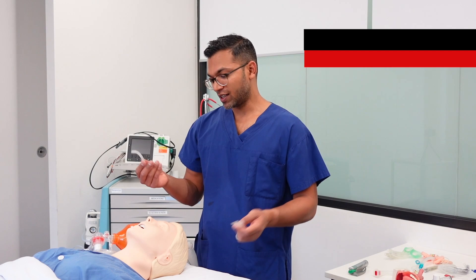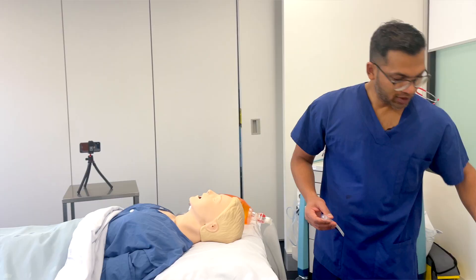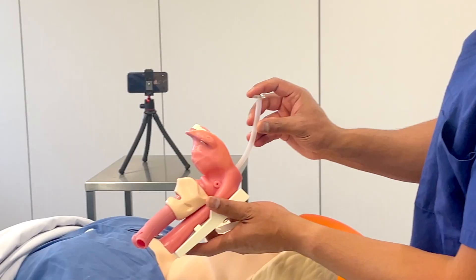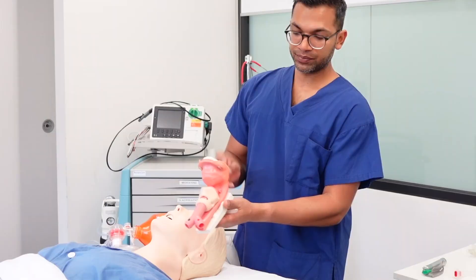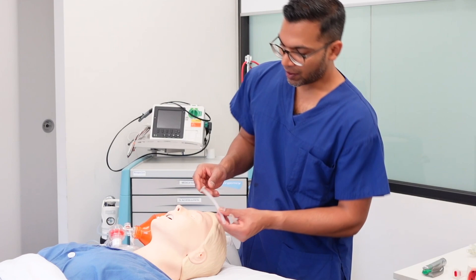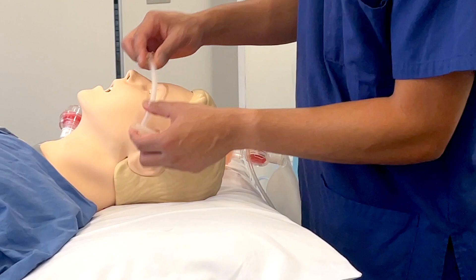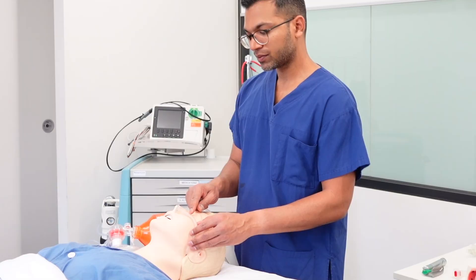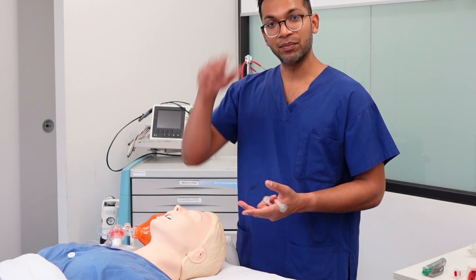The final adjunct is the nasopharyngeal airway, which goes from a nasal angle down through the pharynx, bypassing the tongue and other obstructions to provide a passage of air into the trachea. Sizing is from the opening of the nose down towards the angle of the jaw. Practically, before insertion I apply cophenylcaine spray — a vasoconstrictor and local anaesthetic — to the nostril I plan to use, which reduces epistaxis risk and improves tolerability in semi-conscious patients.